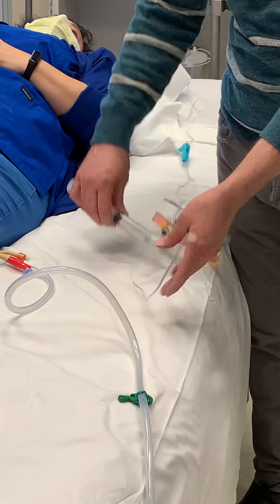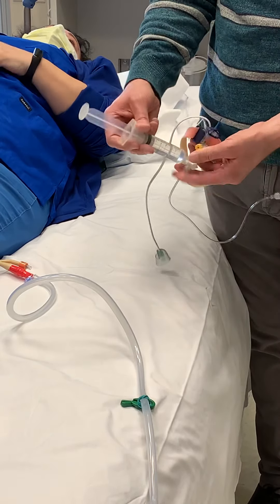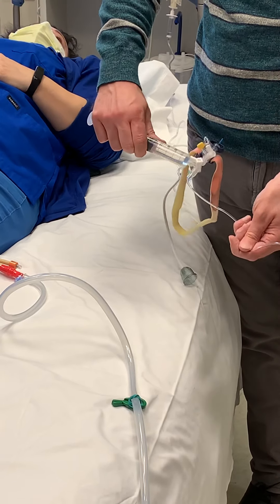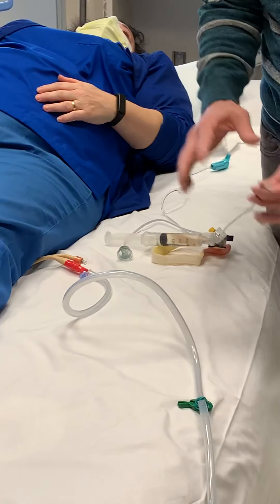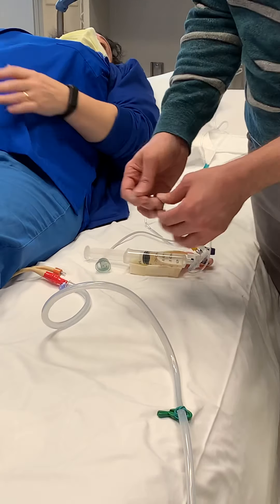You're going to need an additional stopcock and a 30cc syringe. Connect the stopcock and the syringe together. Of course, we're doing all of this under sterile technique because we don't want to introduce any bacteria into the patient.